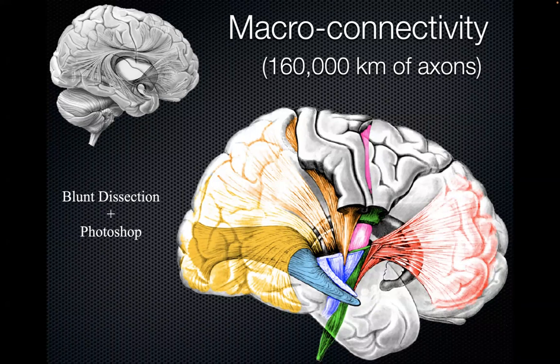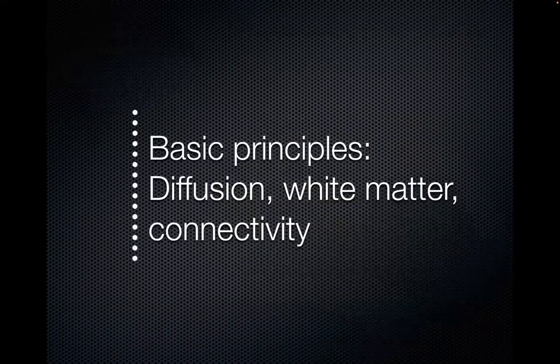And as they come to my spinal cord, out of the spinal cord, they group together and they map the whole motor homunculus. So these individual axons at the micron level group themselves together, form families that we can actually pick up at the millimeter level with MRI. And that's what I want to show you today. How can we infer this microstructure, even though we have measurements at the macrostructure level? So, basic principles.